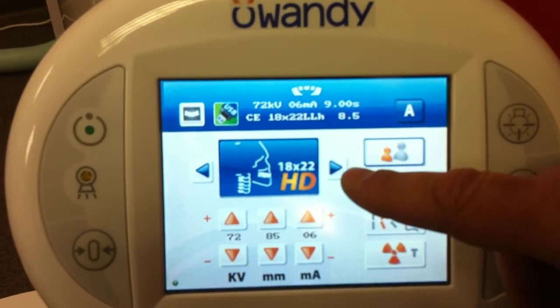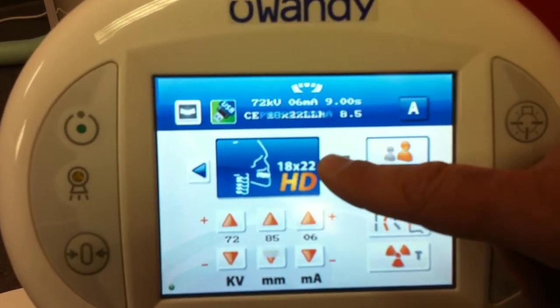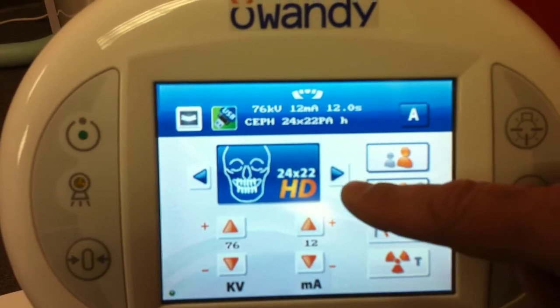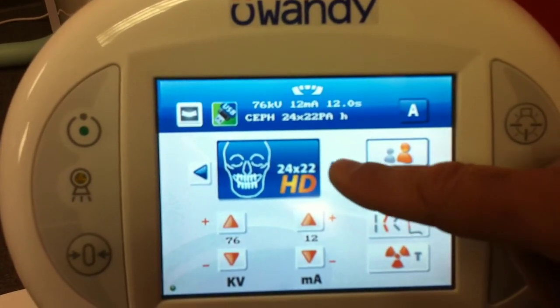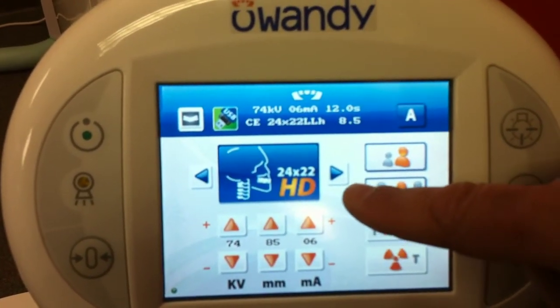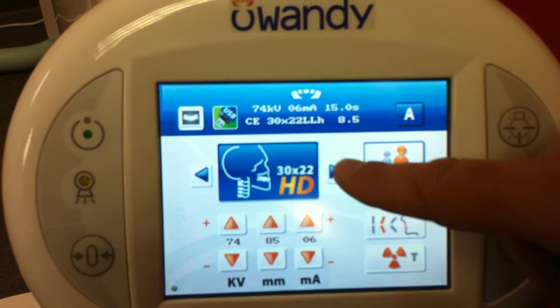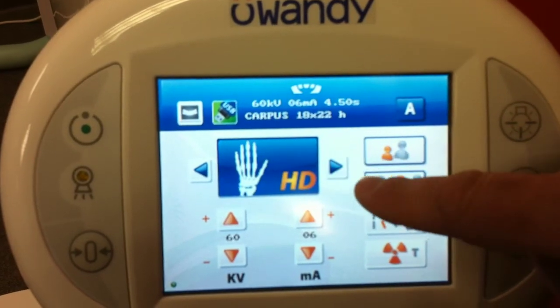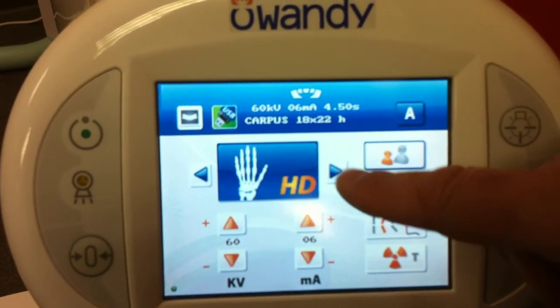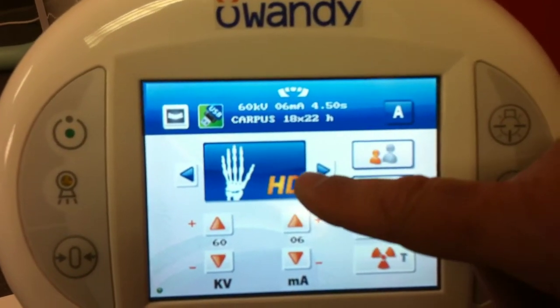In high definition Ceph mode, we have lateral 18x22 high def, 24x22 high def, 24x22 high def, and your 30x22 high def, and your carpus.